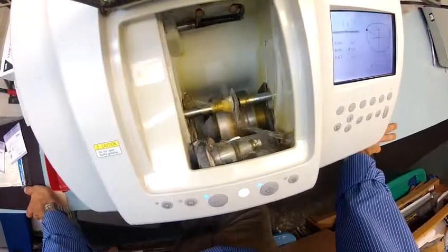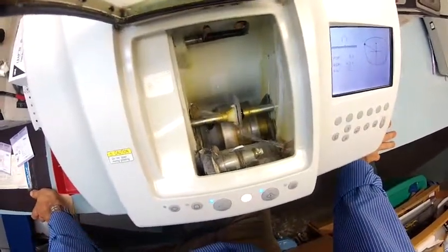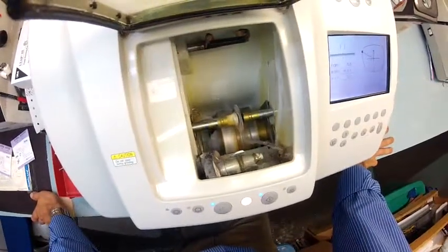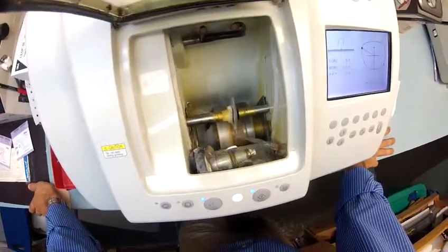So these water jets kick in for the last 20 seconds of the cutting cycle. And then as soon as this is done, we'll take it out and we'll see about getting your left lens inserted into the frame, and then we'll get these overnighted to you.